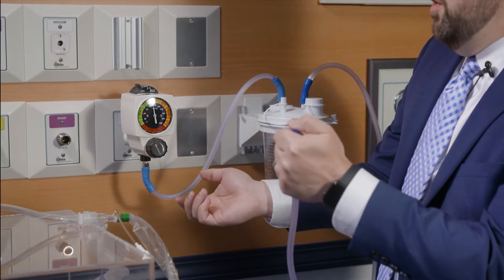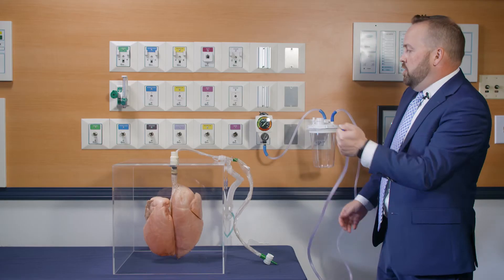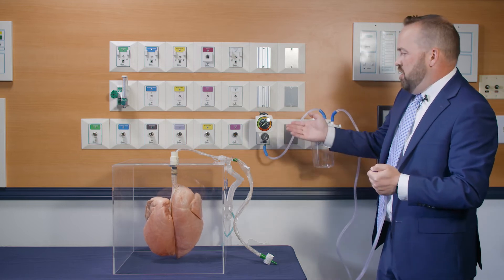So for this example I'm wanting to get to 140. I'm going to keep pulsating and adjust that until I get to the 140 mark. Suction pressure should be starting at about 100 to 120, but go no more than 200, and right now it's set at about 140 or so.